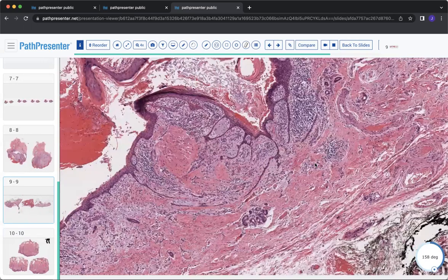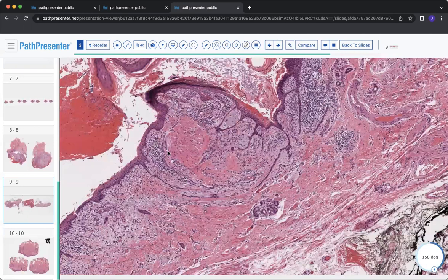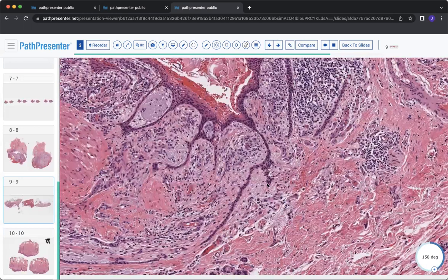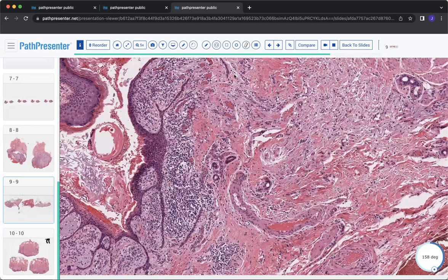However, in a trichodiscoma, as I mentioned multiple times, you're going to have mostly collagen, whereas in a fibrofolliculoma, you're going to have mostly these interconnected strands merging together. And it can sometimes look like a fibroepithelioma of Pinkus. It can sometimes look like a syringofibroadenoma, but fibrofolliculomas, again, are just probably a different orientation of a trichodiscoma.